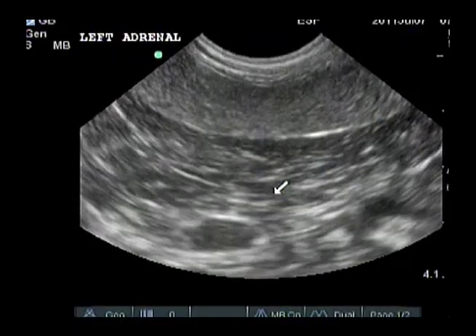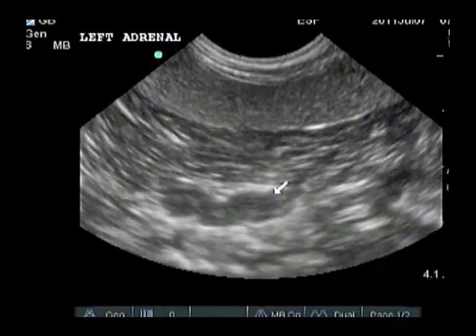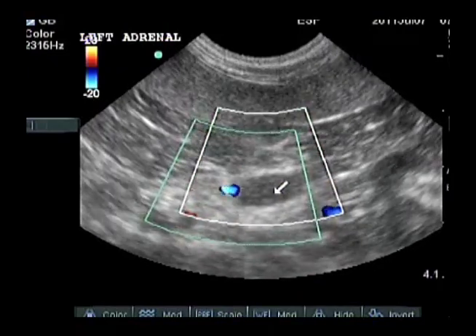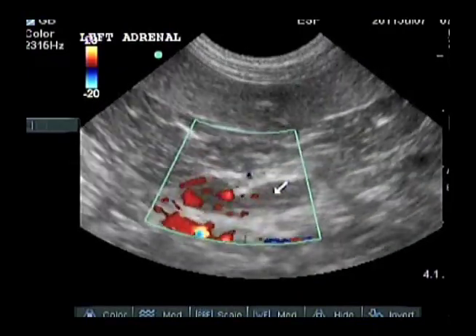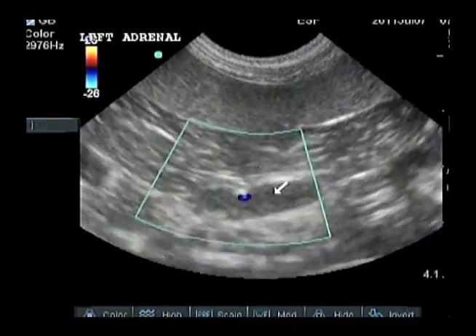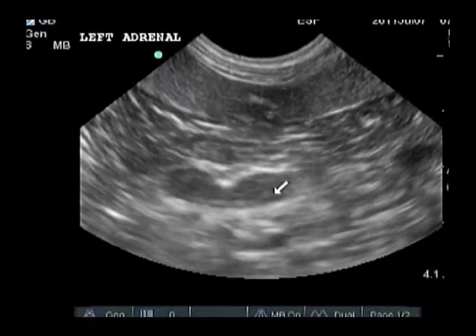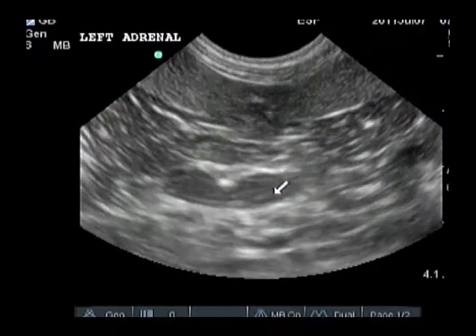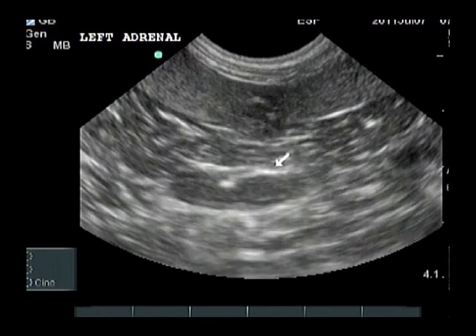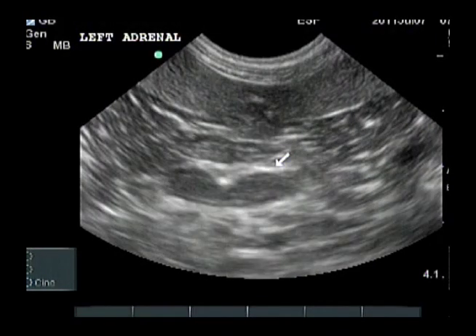Like a video camera, ultrasound machines construct a number of images or frames per second. Most ultrasound machines will store the most recent 75 to as many as 250 or more images in memory during scanning. When you press the freeze button, you can use the cinematic loop or Cine loop to scroll backward or forward to find the best image, make measurements or annotations, and save that image to a permanent storage file in the patient record.